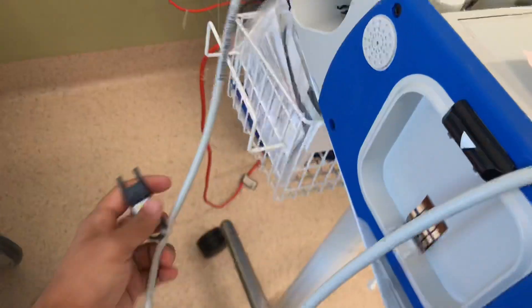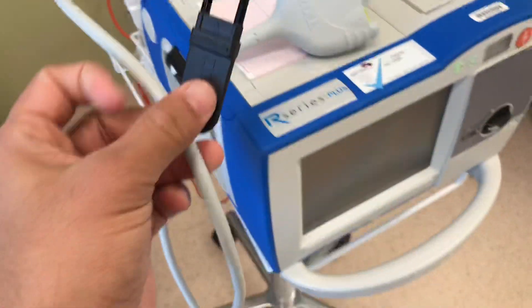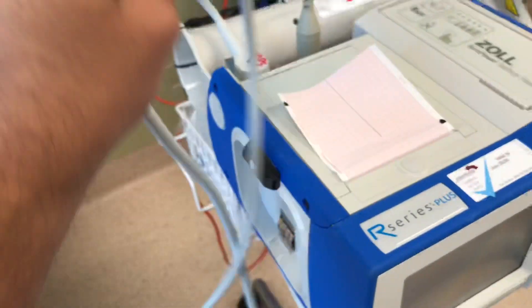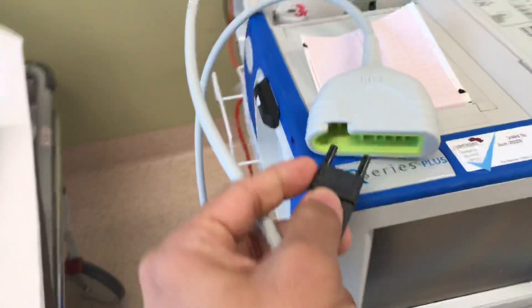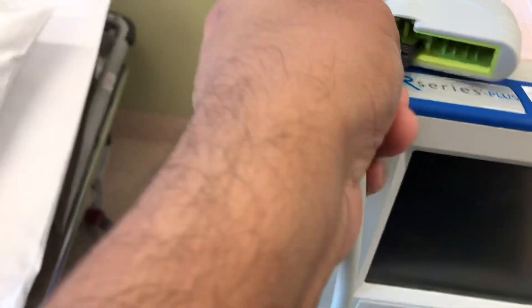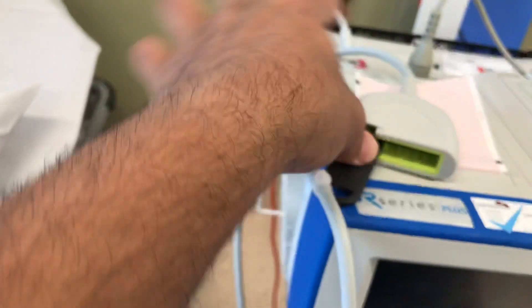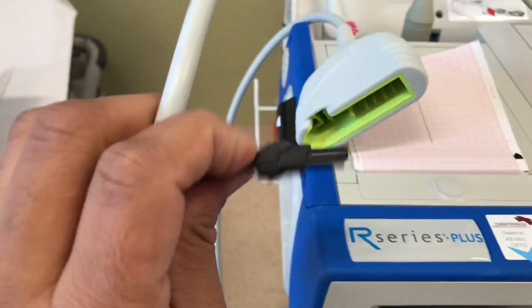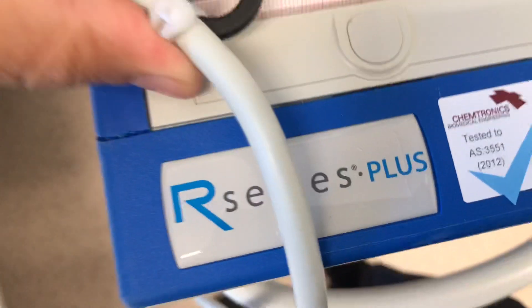There is a test lead which is attached to the cable here, which needs to be connected here. What I'm going to do is push that in. Push that in. So this is on test mode now.